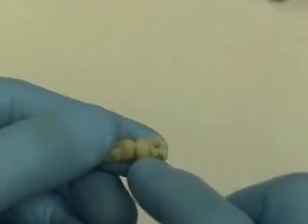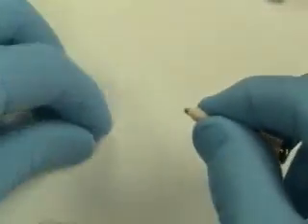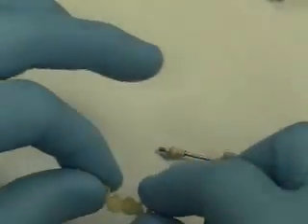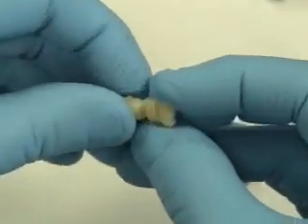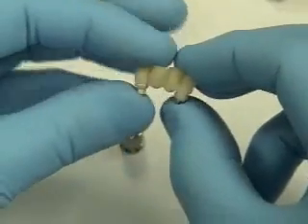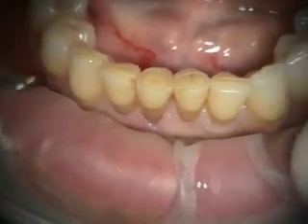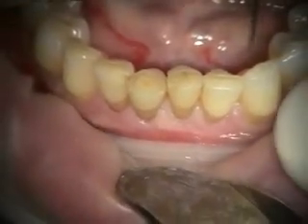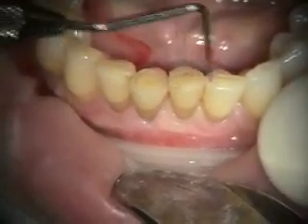I've also made ovate pontics out of the two centrals — you can see that ovate configuration. On one abutment I left the hex on, and on the other I cut the hex off. Because once these two implants are in, if they're not exactly parallel the hexes aren't going to match. This way one will seat into the bevel inside one implant, and the other will index into the hex of the other implant. Plan is to place the implants in the good sites — 23 and 26 — and do a provisional bridge today.